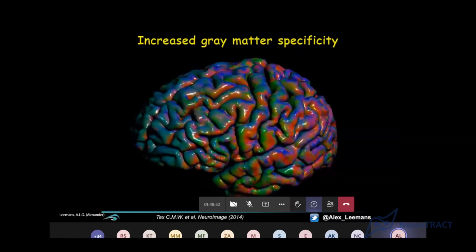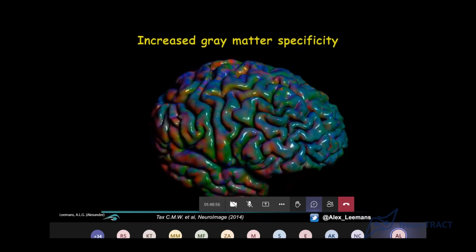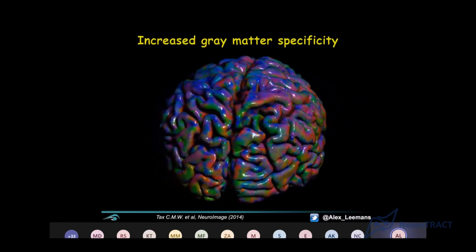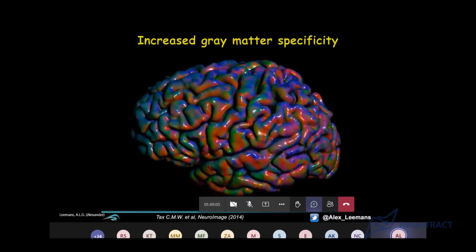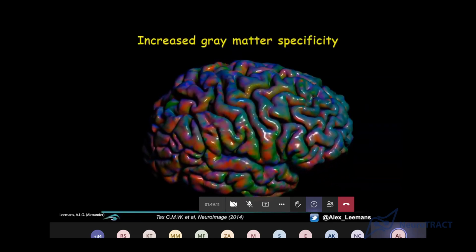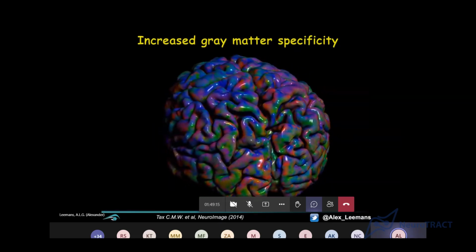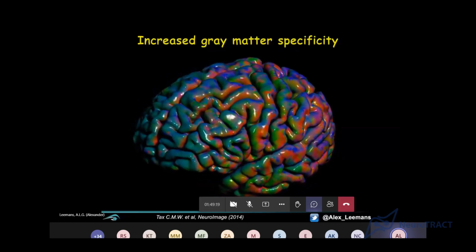On many stainings or drawings or histology images, sometimes we think of the gray matter as a less organized structure, but there's also a lot of organization there, but it's very thin compared to the white matter bundles, right? So some regions, maybe 1-2 millimeters. Well, that's kind of the resolution at which we are acquiring our data.